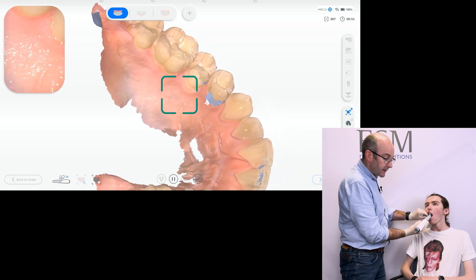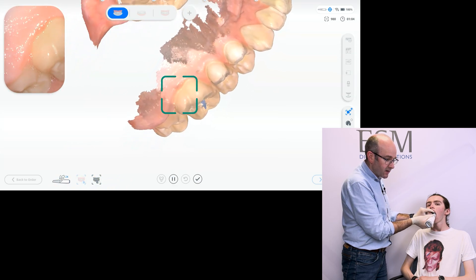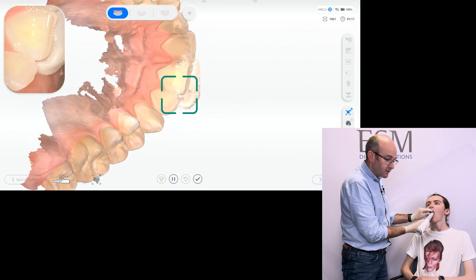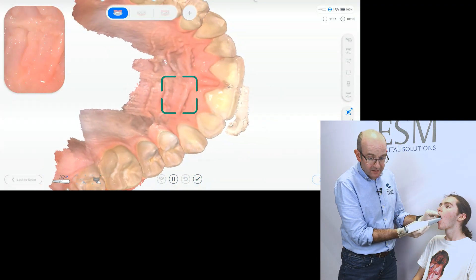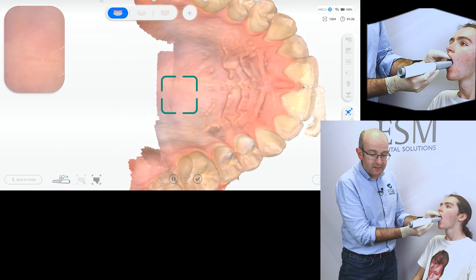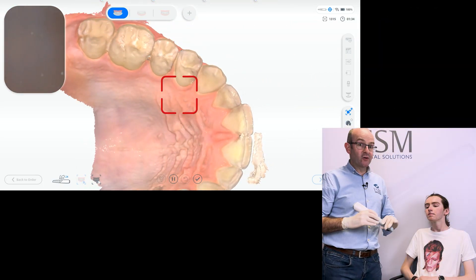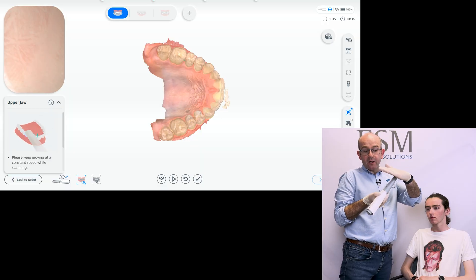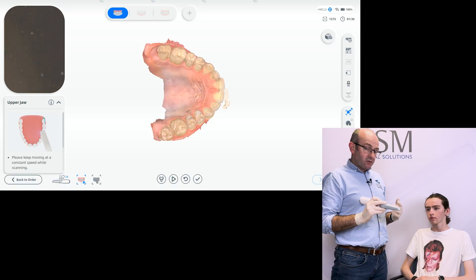We get back into position, turn the scanner on — we started on a molar — and capture the palatal aspect. All the time I'm watching the upper left-hand image in the software, so I can see exactly what the scanner sees. I can see there's maybe a little bit missing interproximally on the incisors — that's fine. To capture the palate, we start at the front and just sweep from side to side nice and steady. Using my left hand to stabilize the scanner also ensures I avoid tricky situations like triggering a gag reflex, and we maintain a certain distance from the palate — we don't touch it and we don't bounce off the tongue either.